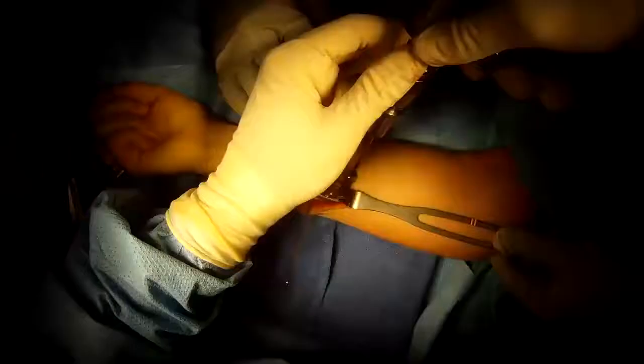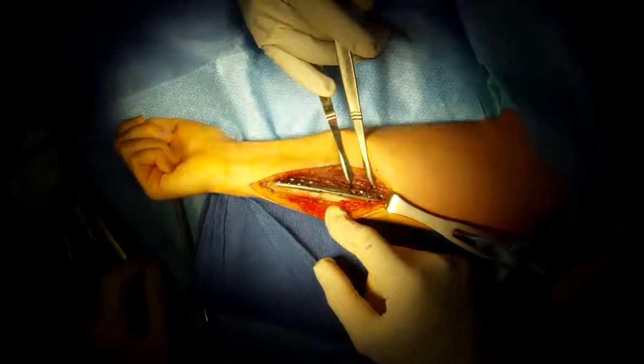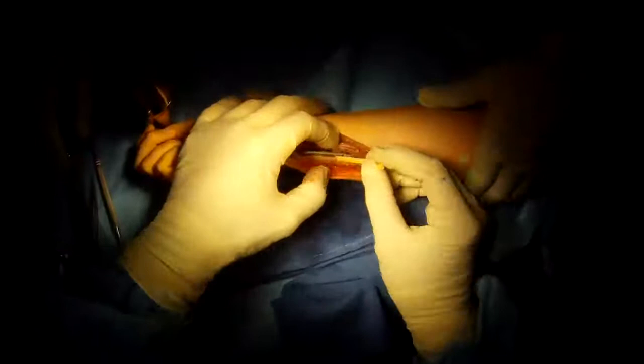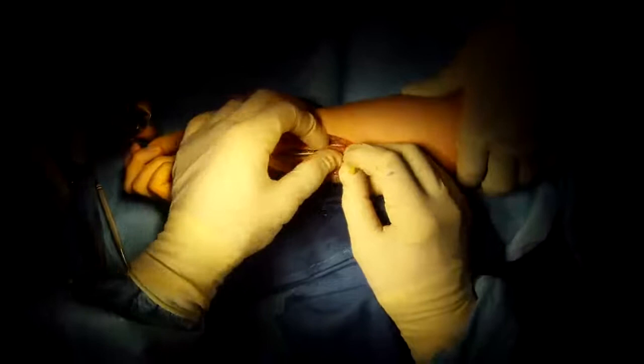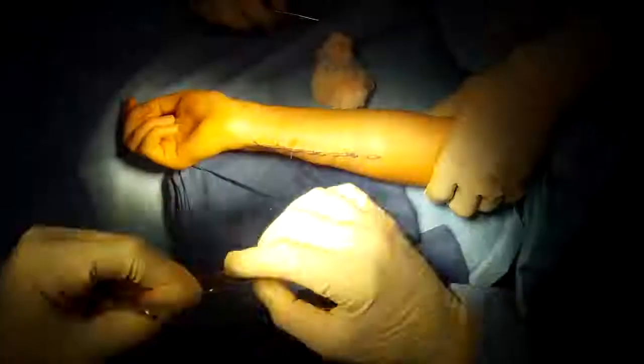Now we place the remaining screws on the plate — again, locking screws placed through special guides. All done. Very stable osteotomy, very precise, very well opposed. We place some synthetic bone graft to facilitate healing even further, then close it up. All done.